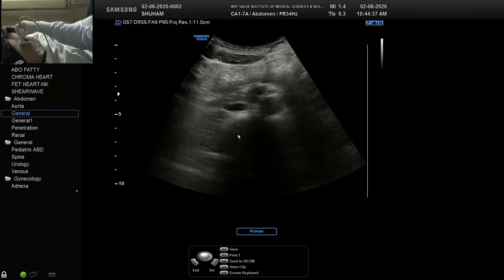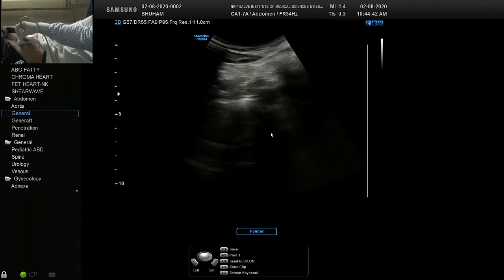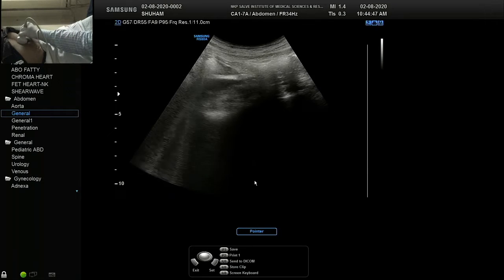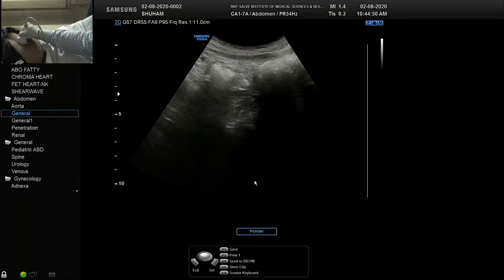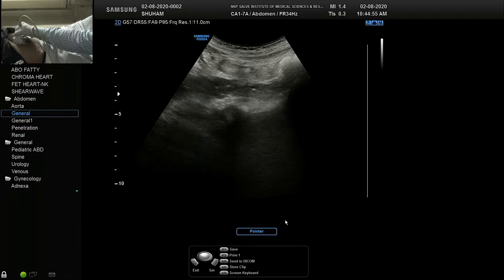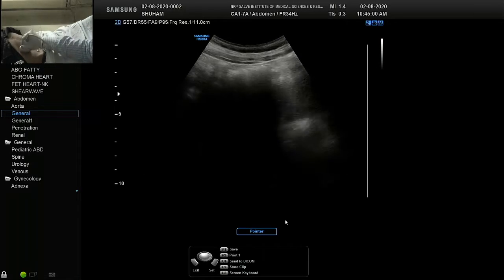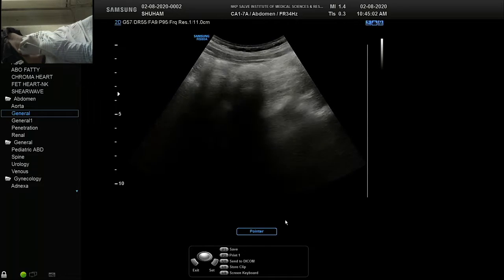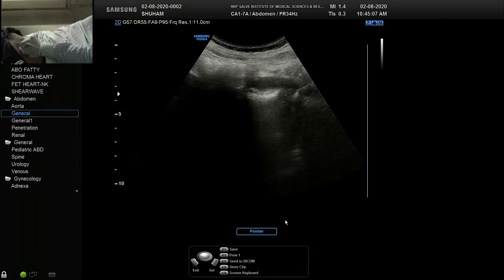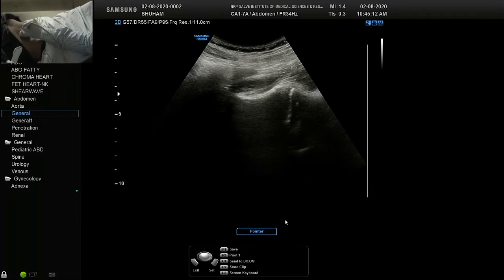So this is a confluence, the right and left. They are not much distended, so you are not able to see them nicely. Still we'll see the vein here, the IVC rather. There are gases, so I'll take a different approach. Take from this side and try to see the IVC. That is aorta. This is IVC.